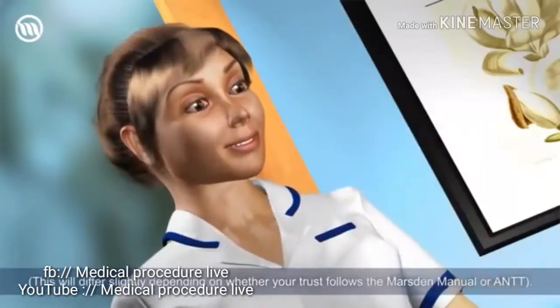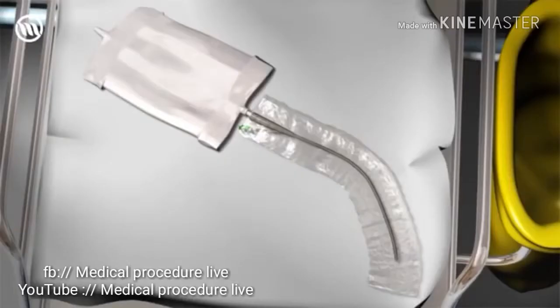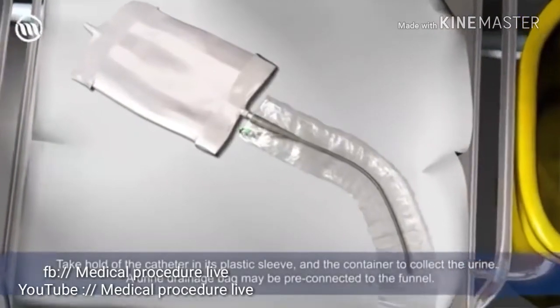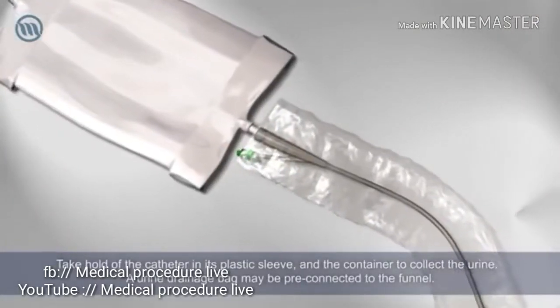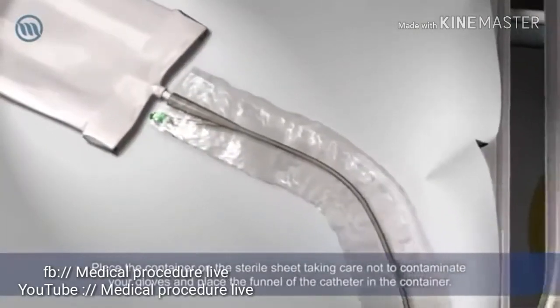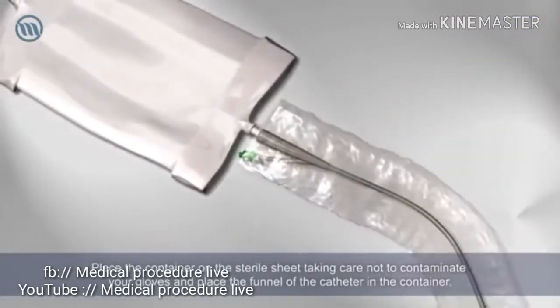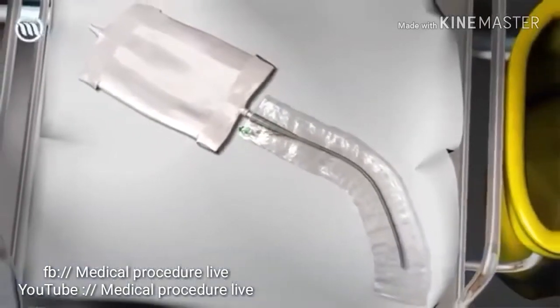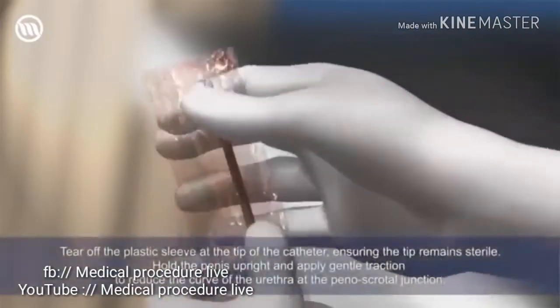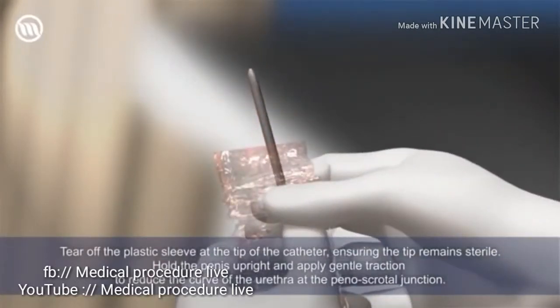This will differ slightly depending on whether your trust follows the Marsden Manual or ANTT. Take hold of the catheter in its plastic sleeve and the container to collect the urine. A urine drainage bag may be pre-connected to the funnel. Place the container on the sterile sheet, taking care not to contaminate your gloves, and place the funnel of the catheter in the container. Tear off the plastic sleeve at the tip of the catheter, ensuring the tip remains sterile.